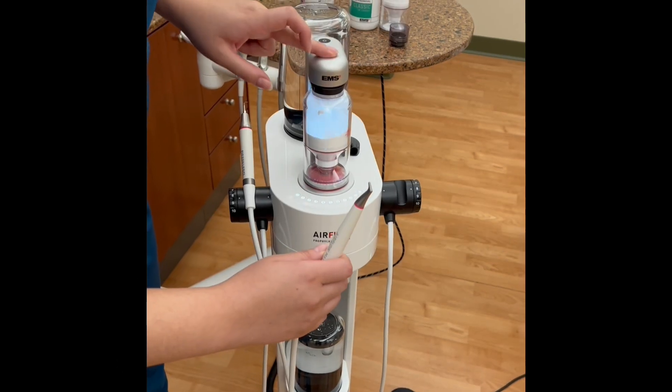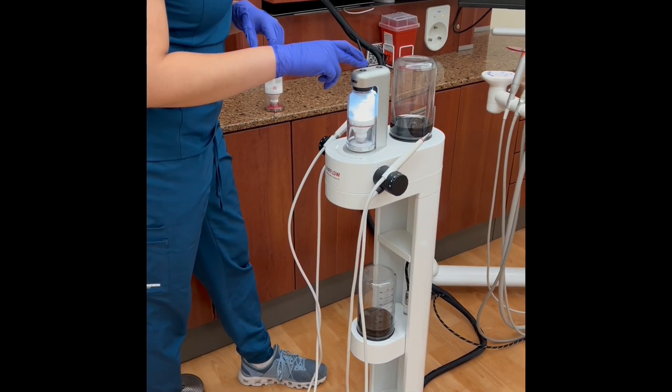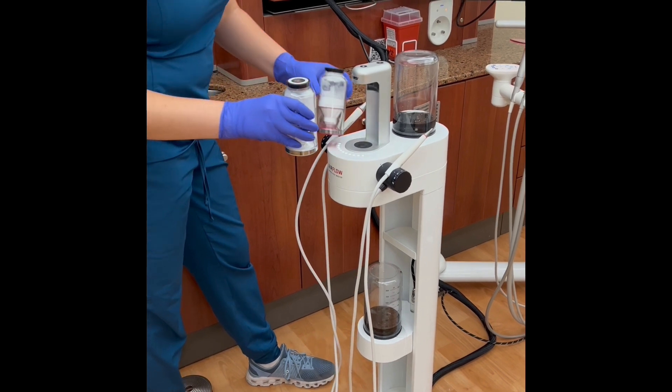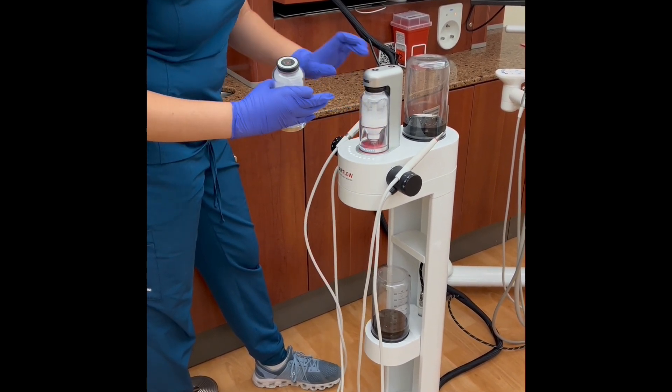The button in front pressurizes the chamber so that it's ready for use. To switch out powder canisters, press the pressure button on top of the canister and wait for the pressure to release. Switch the canisters and then press the pressure button again.